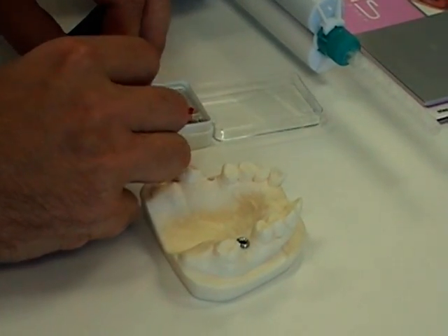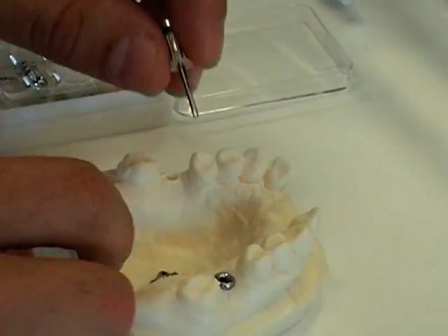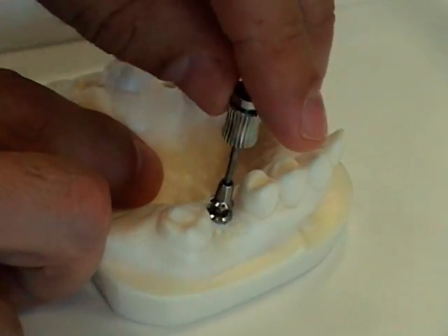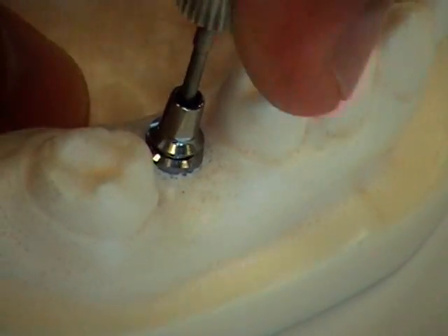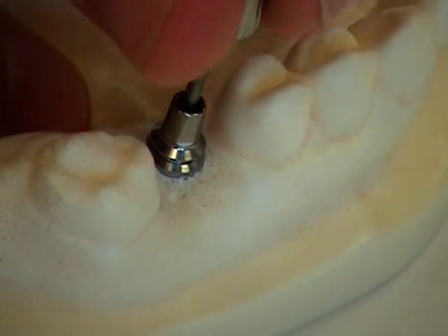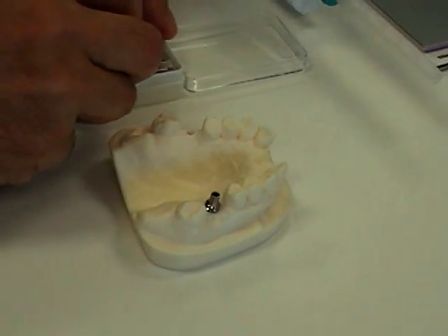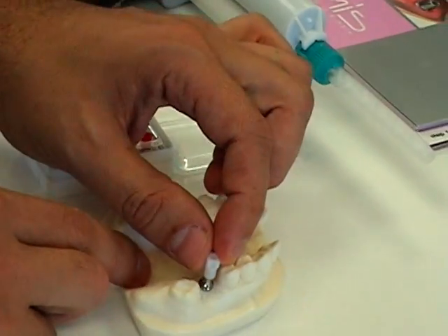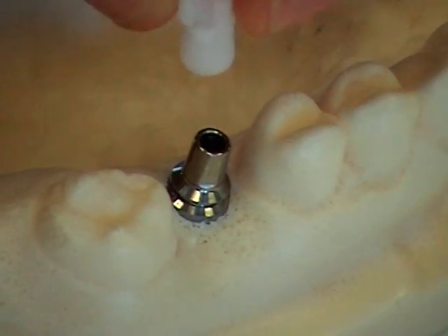Next, we will place the abutment using the same driver and the included screw. It is recommended to keep the flat side of the abutment towards the buccal wall. Once the screw is tightened in, seat the snap-on plastic impression coping on the top of it. Notice that there is a flat side on the inside of the plastic that corresponds to the flat side on the abutment itself.